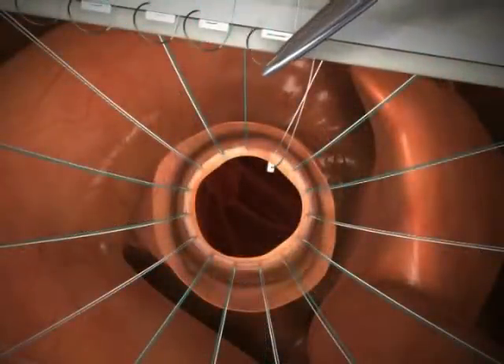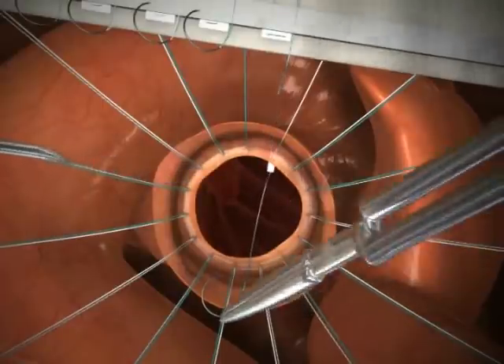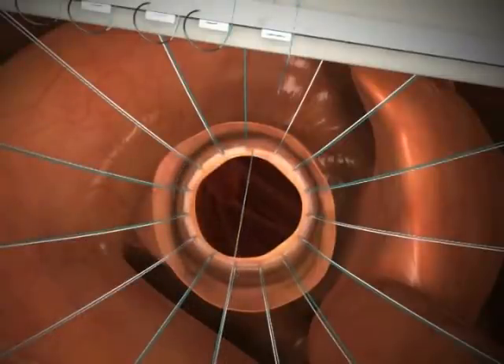If suturing is completed using only a portion of a suture pack, cut the suture after the last required needle. The last needle must be placed in close proximity to the first stitch placed. This is the same as would traditionally be done with a conventional technique.